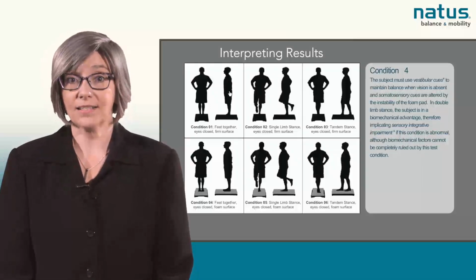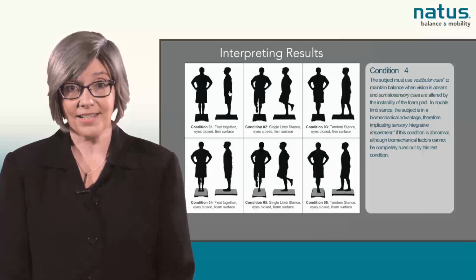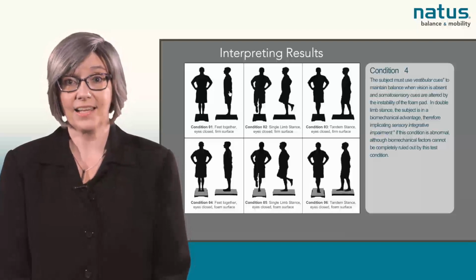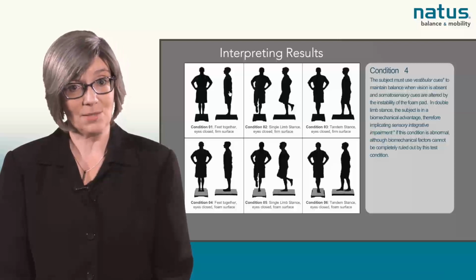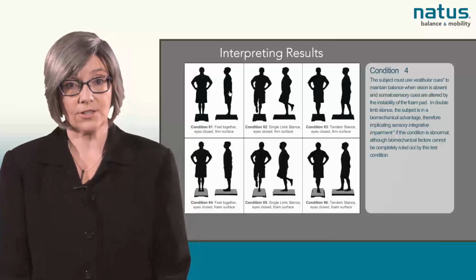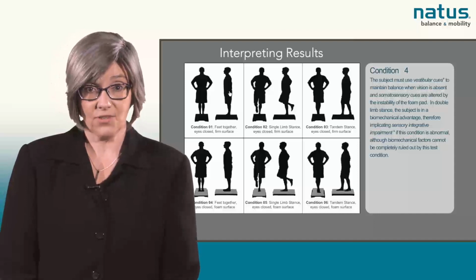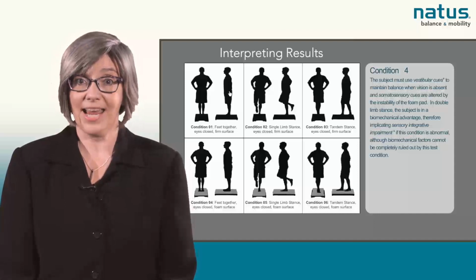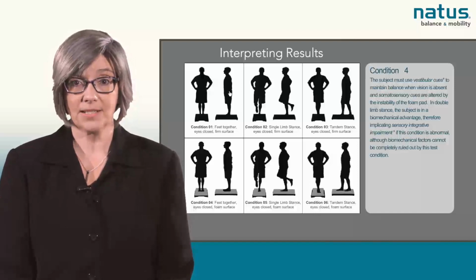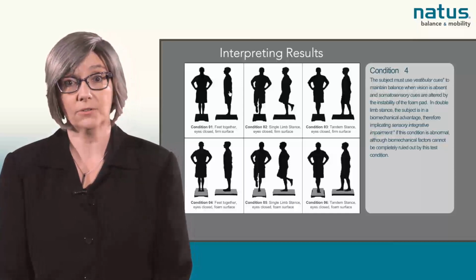Condition 4 is double limb stance, or feet together, hands on the hips, eyes closed on the Airex foam pad, which is an unstable surface. The patient must use vestibular cues to maintain balance with absent vision. Somatosensory cues are altered by the instability of the foam pad. The feet together stance for this condition gives the patient a biomechanical advantage. Abnormalities may implicate sensory integrative impairments, although biomechanical factors contributing to the impairment may not be ruled out.